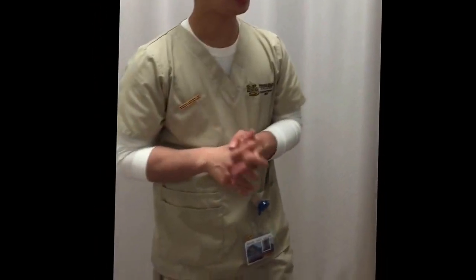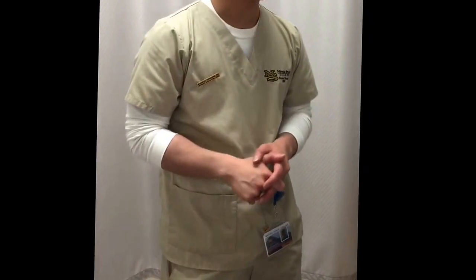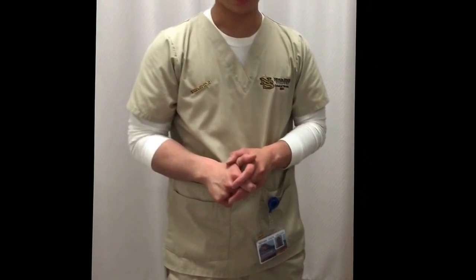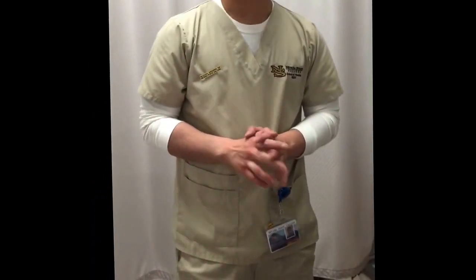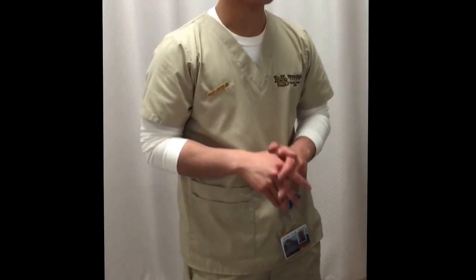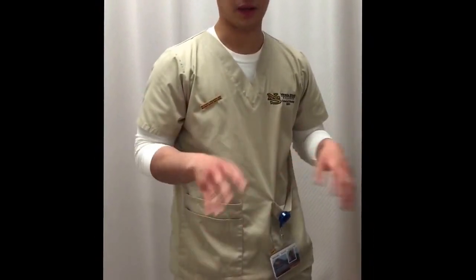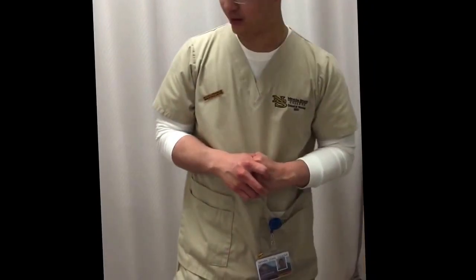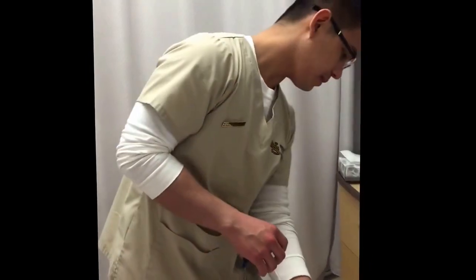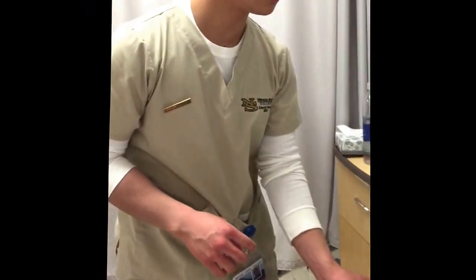That's good. Okay, the doctor ordered an indwelling catheter for you today. Are you aware of that? Yes. Okay, have you ever had one before? Yes. Okay, so it shouldn't be painful, but if you feel any discomfort or pain, just let me know, okay? Yes. And I'll guide you through the whole process. Is that okay? Yes. All right. Let me just pull this up. Are you allergic to iodine or latex? No. That's good.